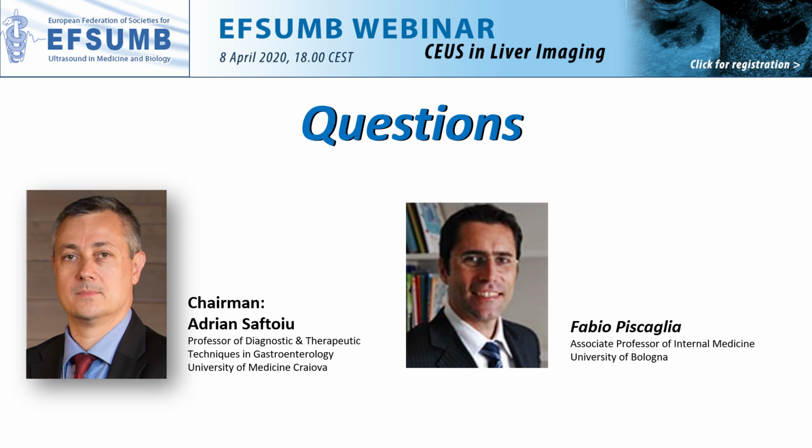No, the follow-up is mainly on CT and MRI because they are panoramic. When you have a lesion that has been treated for hepatocellular carcinoma, you are at high risk of having hepatocellular carcinoma also somewhere else, and other new lesions. CEUS is good to establish whether the treated lesion is dead or alive, but this is not enough. We have to look also for other lesions elsewhere. And we know that the sensitivity of ultrasound is not very high. So this is why at least twice a year you need CT or MRI.